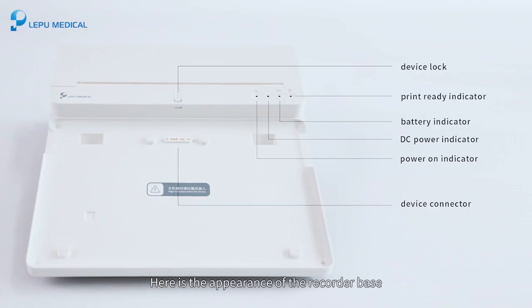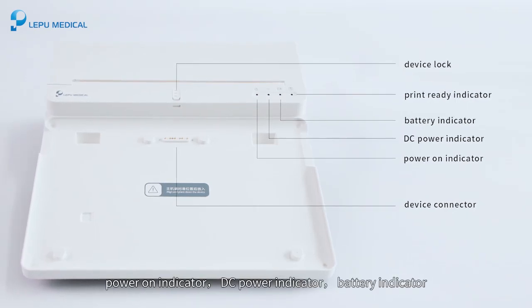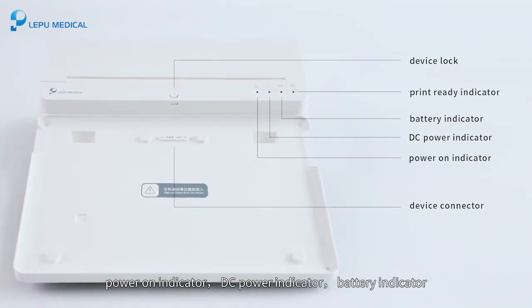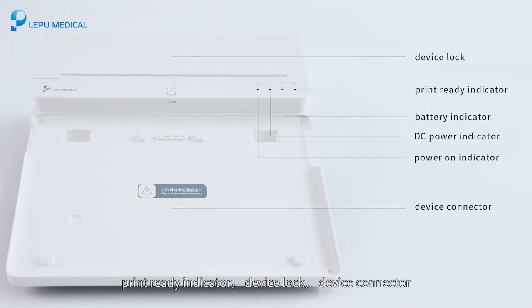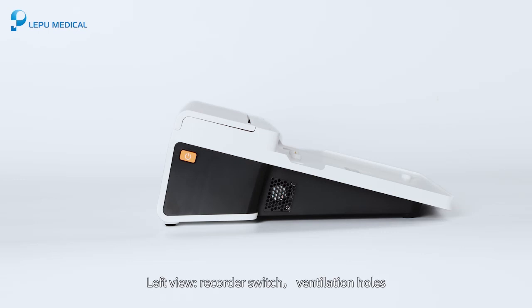Here is the appearance of the recorder base. The front view shows the power on indicator, DC power indicator, battery indicator, print ready indicator, device lock, and device connector. The rear view includes the battery compartment. The left view shows the recorder switch and ventilation holes.